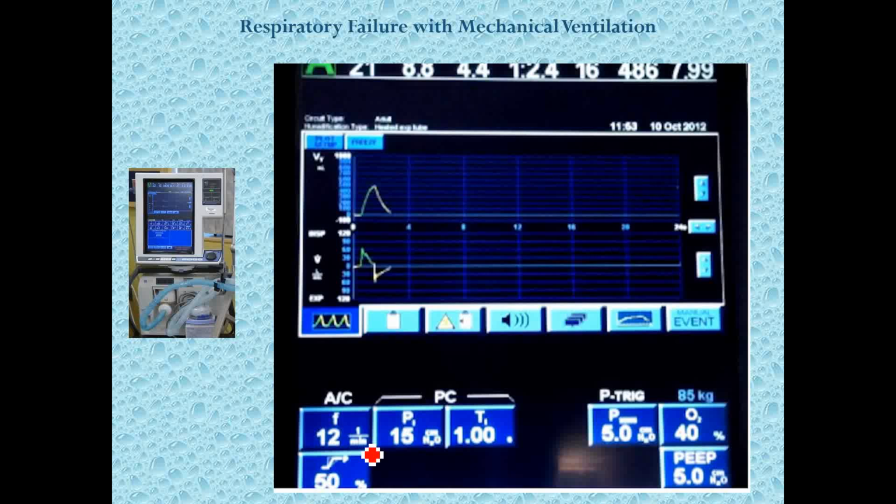All right, so let's look at a ventilator screen. And this is probably my favorite model of a ventilator. This is kind of like the Volkswagen, the cheap version of a ventilator. There are some fancy Cadillac models, but all of them do have the same components or the same things that individuals can do to use them. The biggest key is for you to figure out where that is, and you will as you look at different ventilators. So let's look at this ventilator, and we can see that with each breath, you can see the waveform that's on the screen. So a waveform will appear.